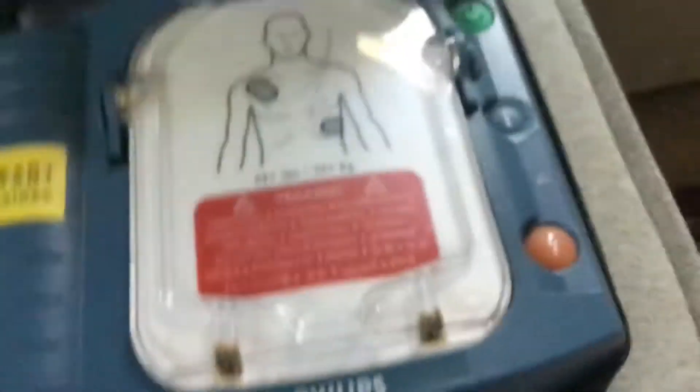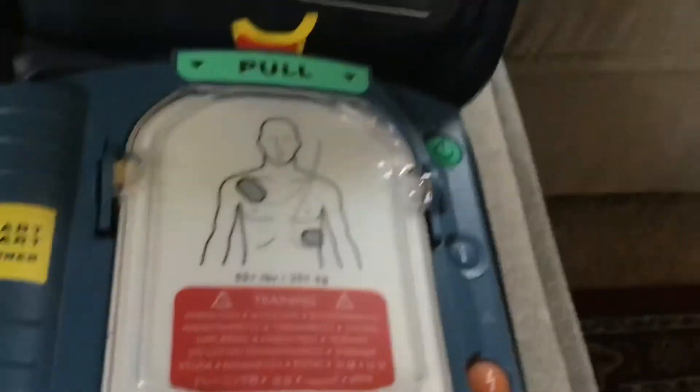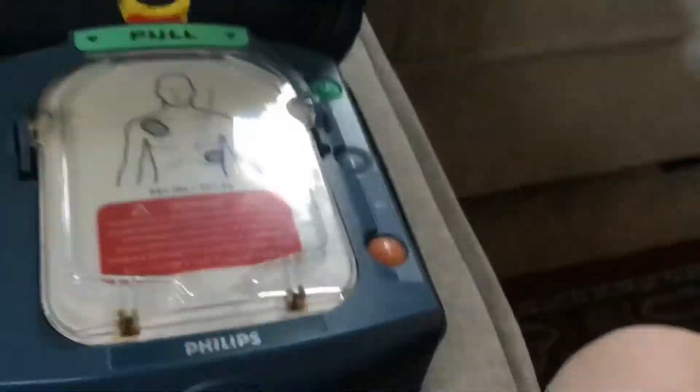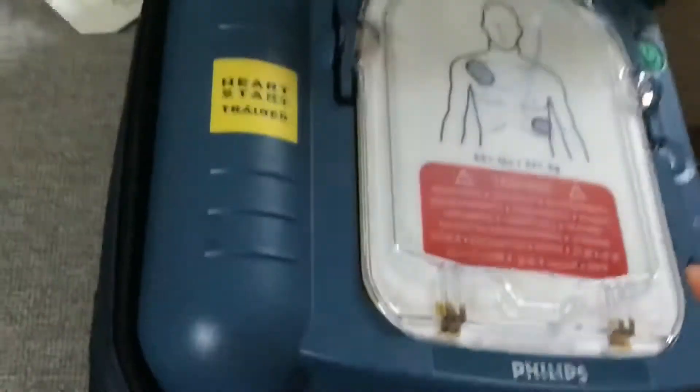Welcome back to another video. I'm going to show you how to replace pads inside a Philips HeartStart Home. These are adult real pads. When I put them in it's going to say 'cartridge type not recognized,' but in the real one it'll say 'adult pads.' This will say 'adult training pads' because these are trainer pads and this is a trainer HeartStart training device.